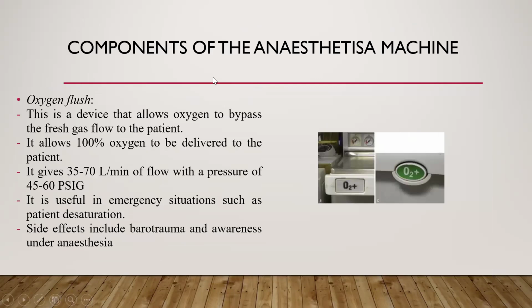The oxygen flush: many of us were in love with the oxygen flush, but let me warn you here. Oxygen flush is not without its adverse effects, but it comes in handy during emergencies.